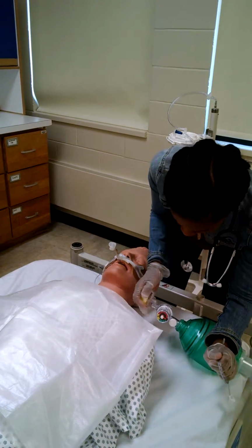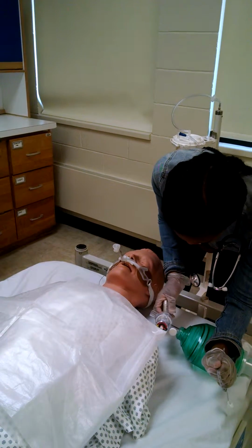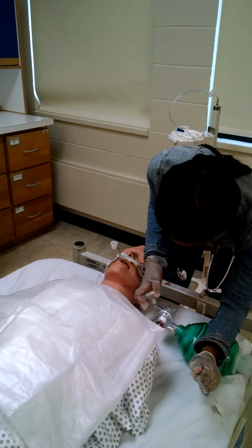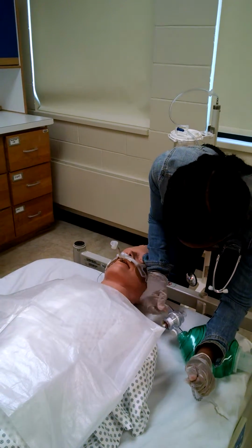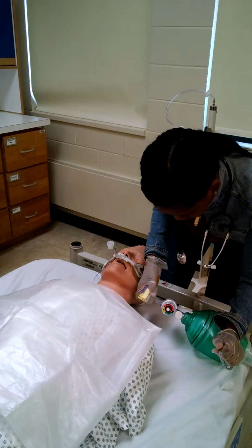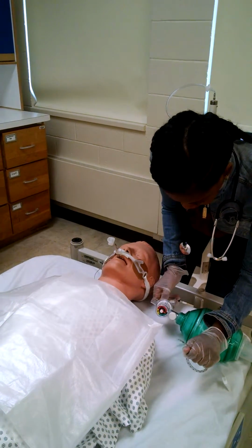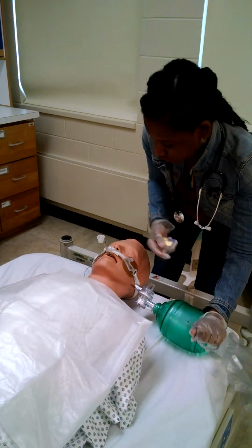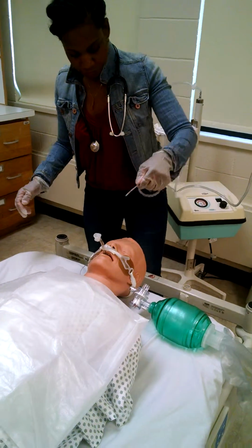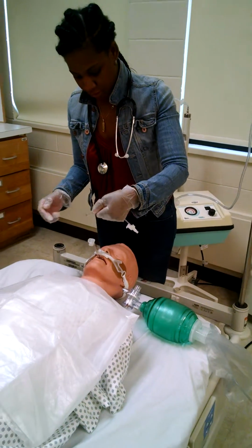Should have done this before I put on my glove. So I would have checked for my CO2 on the patient, but I can't get that on right now. I've hyperventilated the patient already, so I'm going to go ahead and suction.